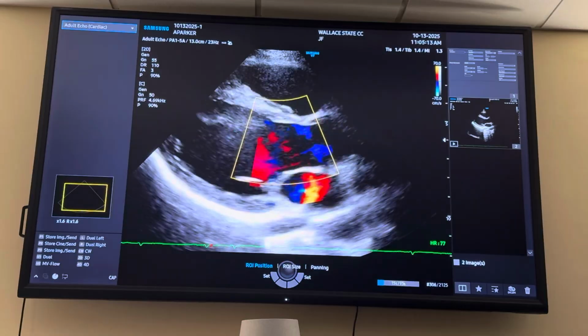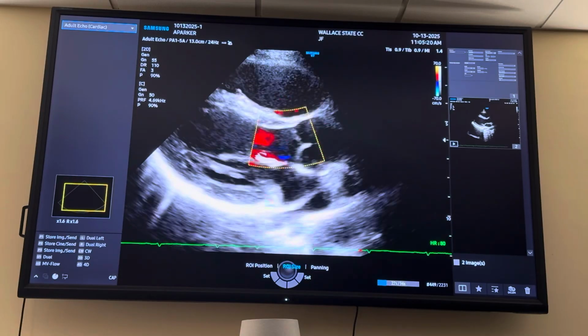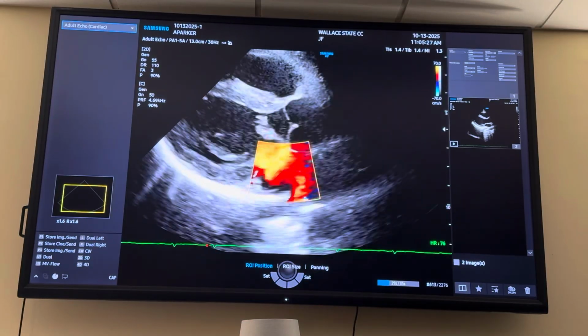If you feel like you need to focus more on aortic insufficiency, which nobody has here, you can take two separate images. As long as you have color included on both of your valves and clip store, you should be good.